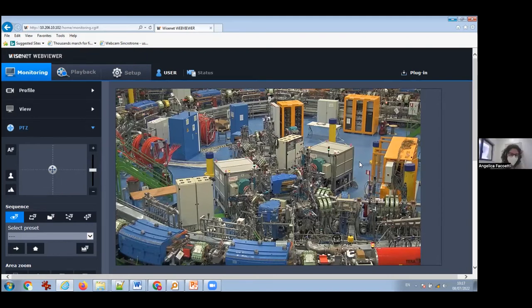Matthias. Yeah, then another question regarding the Betatron resonance or the knockout extraction. If the knockout extraction is ready, will you use knockout extraction exclusively, or will you still use the Betatron for the standard treatments? Hard to say now. I guess that as soon as the RF knockout is operational, it will probably become the standard extraction system. But still, we will not remove the Betatron from the synchrotron.